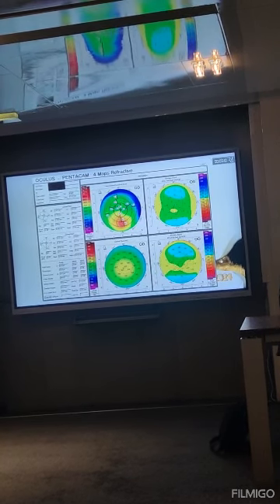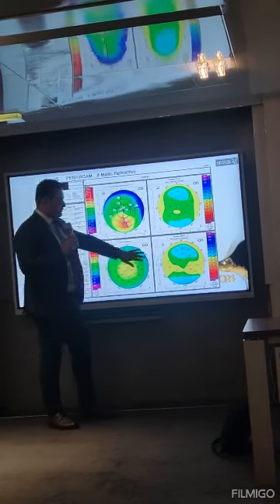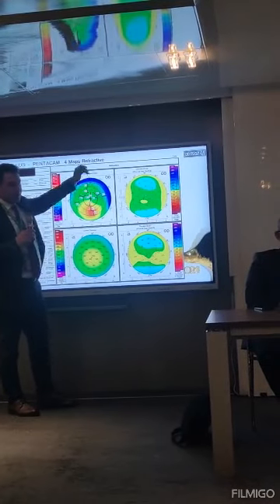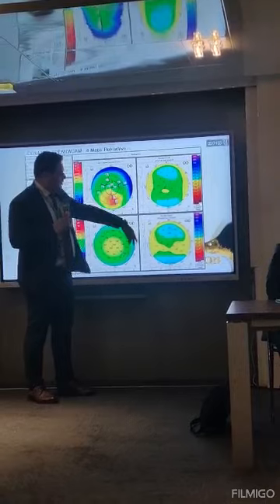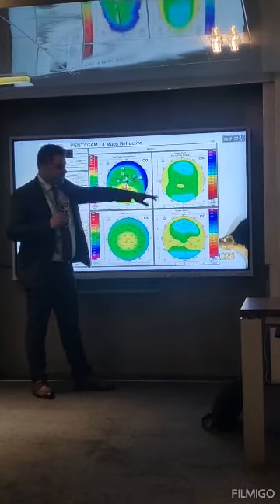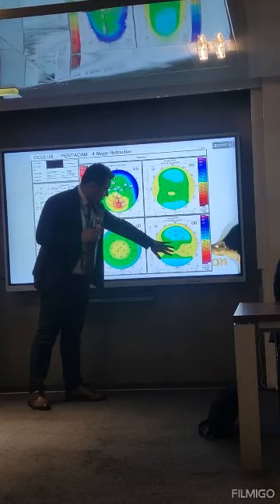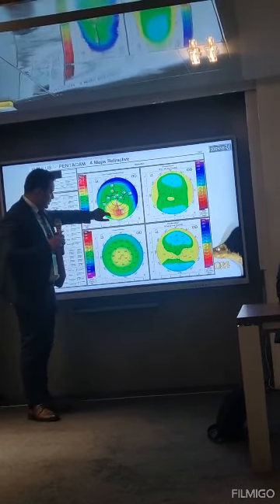Okay. So, we all know that the Pentacam is essentially measuring an elevation, and then the elevation is converted to curvature maps. So the main thing that we measure with the Pentacam is the elevation. For example, Michael Belin is always telling us that he doesn't look at the curvature map, he just looks at the elevation maps. But we look at all maps, of course. We can see that the elevation maps are normal, as Dr. Mazen mentioned. We see this suspicious area here.